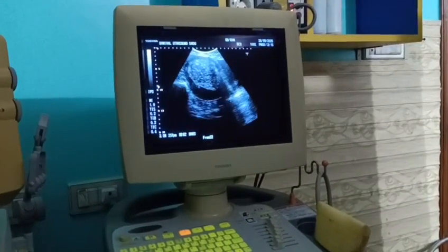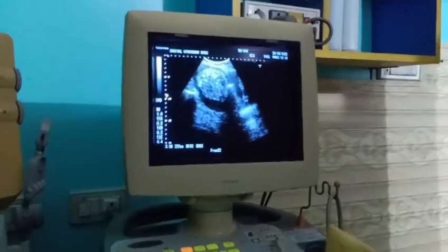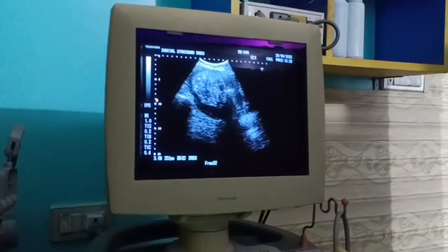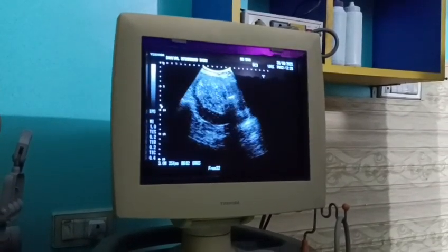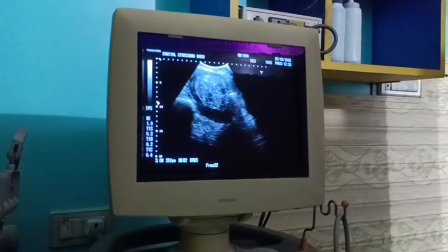Welcome back. We have got a patient. She is about 65 to 70 years old. So this is a post-menopausal case. She's complaining of heavy bleeding and pain in the lower abdomen and vaginal areas. Now on ultrasound, let's see what is coming out.